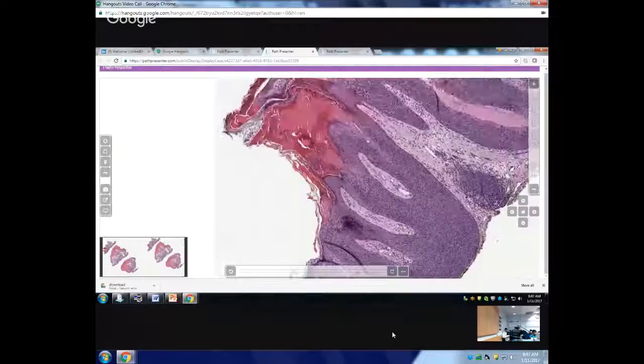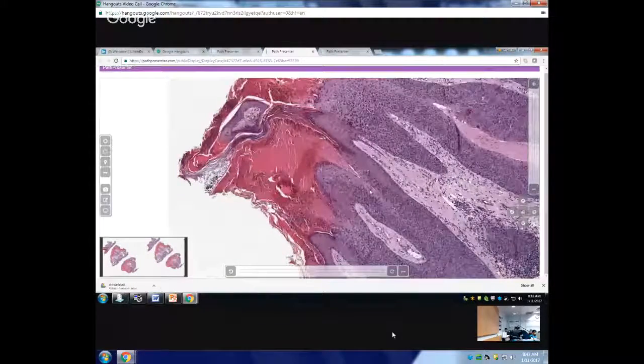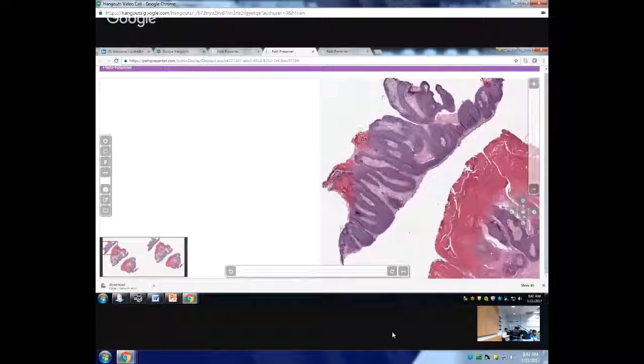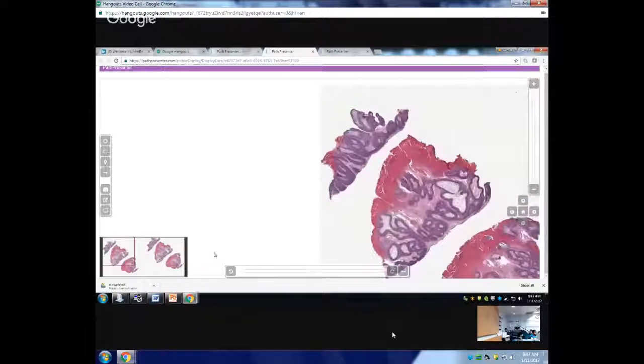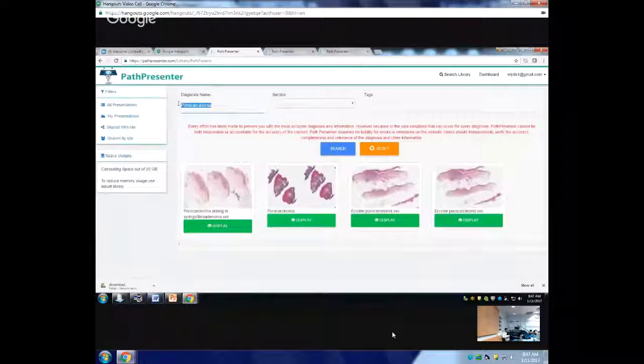What is the other feature in squamous cell carcinoma that you always see on the top? What do you see on the top of a squamous cell carcinoma? A lot of parakeratosis. No? When you look at a squamous cell carcinoma, let's go to squamous cell carcinoma.